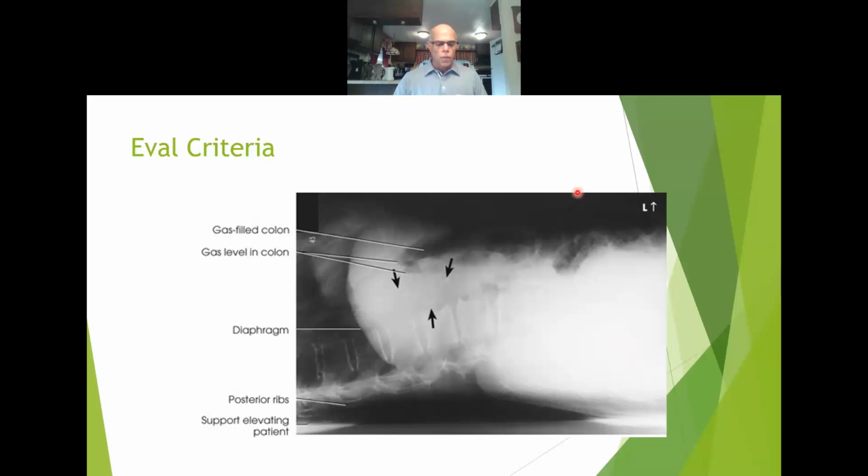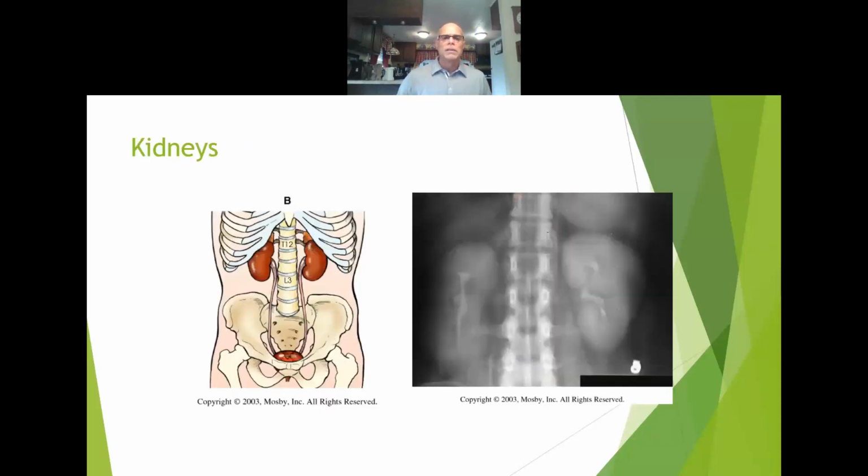And that is on page 142, guys. I wanted to show you this just to give you an understanding of KUB. Kidneys, ureters, and you see where the bladder is. And again, if you get right there at the upper margin, you'll be able to say that you got the entire bladder. Here again, you see this is L3. If we center right there, that's giving us what level? L4, iliac crest, or the ala. Here's your greater trochanters, sticking out right over here.